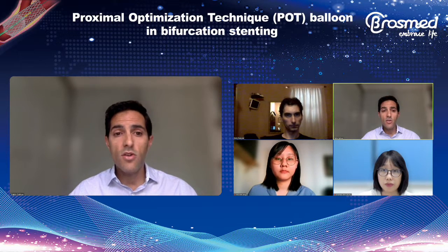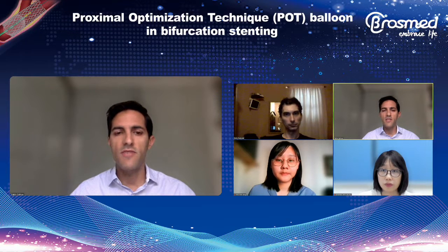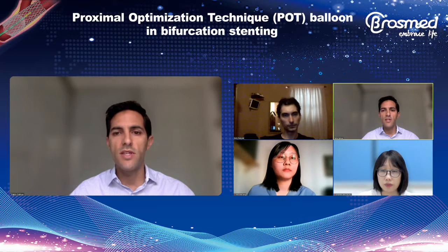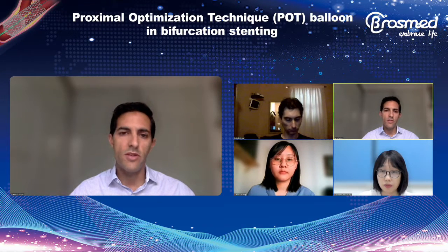In my talk, I described how the BrosMed balloon helps to make results predictable in precision PCI in the most complex cases, such as calcified disease, and also two-stent strategies, which are now turning into dual kissing strategies, but also, more importantly, triple POT strategies.